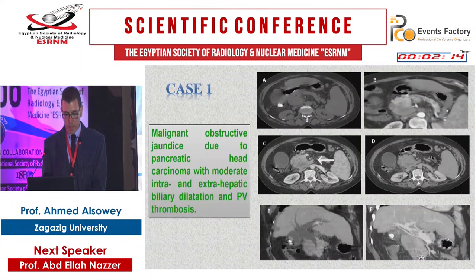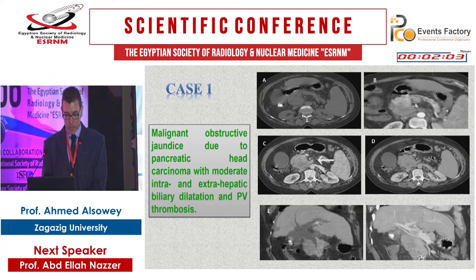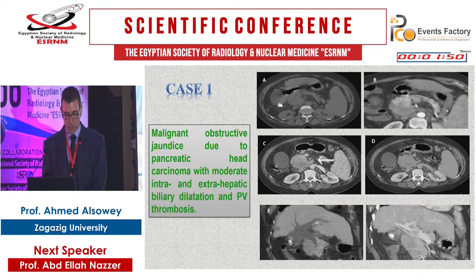This is a case of malignant obstructive jaundice due to a pancreatic head mass, shown on axial pre-contrast, arterial, portal venous, and delayed phase images. The coronal minimum intensity projection revealed dilatation of the common bile duct down to its distal end as well as partial filling defect within the portal vein. This represents malignant obstructive jaundice due to pancreatic adenocarcinoma with moderate biliary obstruction and portal vein thrombosis.